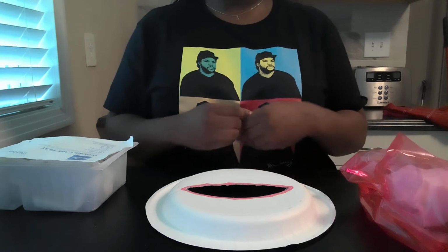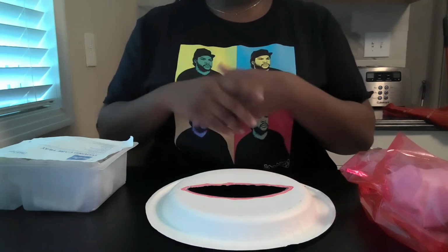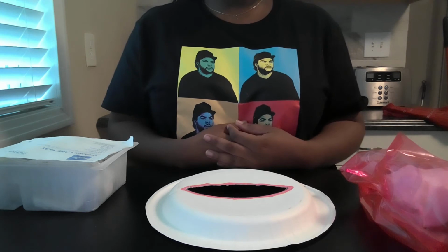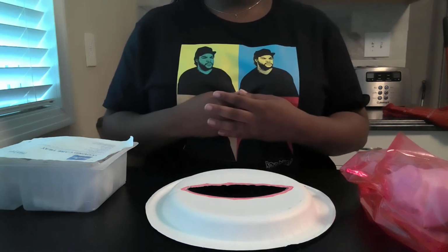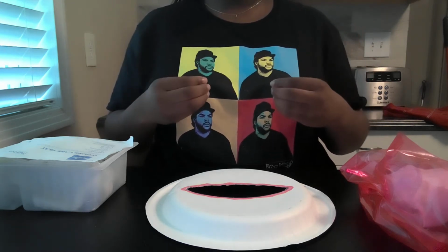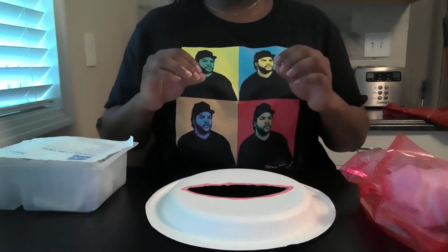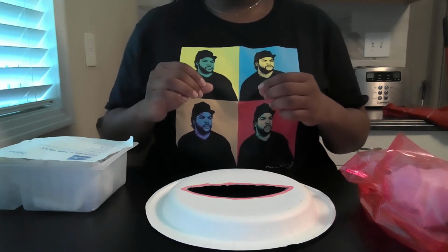Once I've done that, I'm going to take off my unsterile gloves and throw those away in the proper receptacle. Okay, now it's time for me to don sterile gloves. Before you do, you want to make sure that the packaging you're taking your sterile gloves out of is not torn in any way, and that the packaging isn't wet.